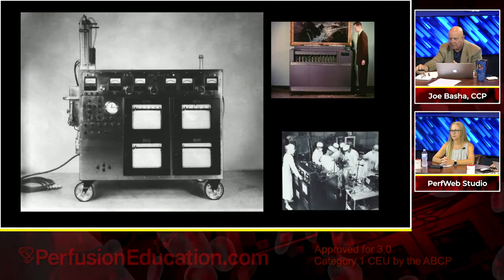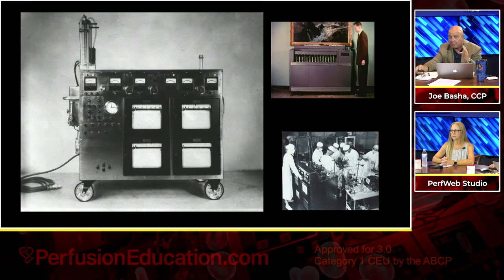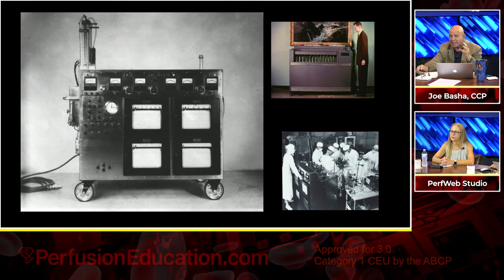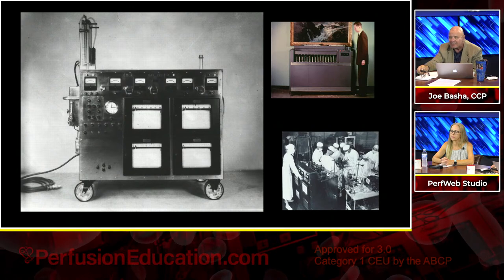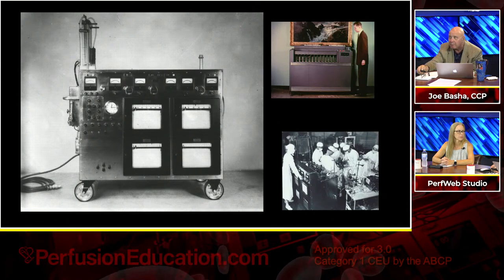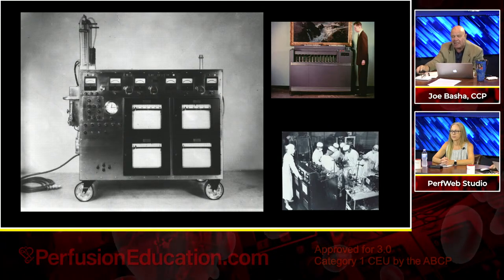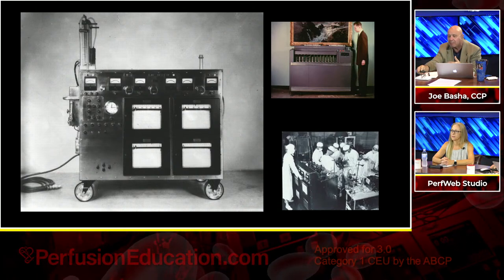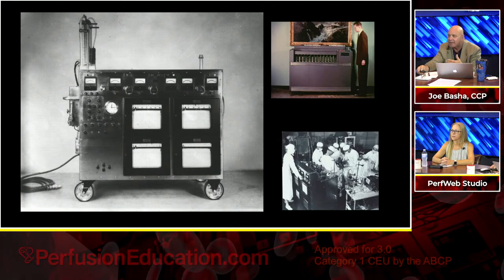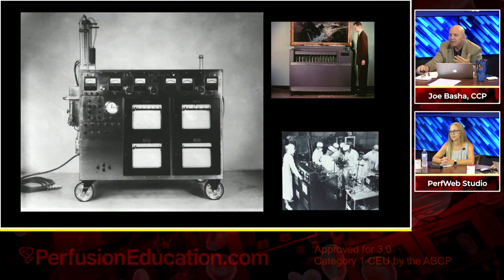So moving on to the IBM Gibbon II, which is what's pictured on the left. This came from Bill Stoney's book. And that heart-lung machine that you see there is in the museum at Thomas Jefferson University, where it was first used on Cecilia Bavolek in 1953 for closure of an ASD. But if you look in the upper right-hand corner, you see an IBM punch card business machine. Again, you see the influence of how IBM decided what this machine needed to look like.